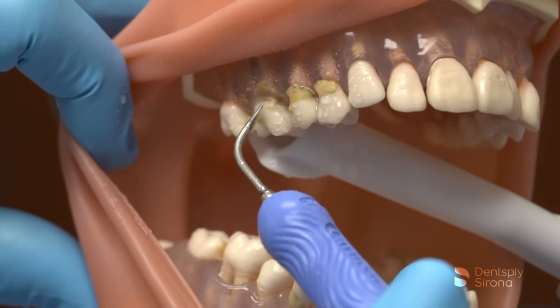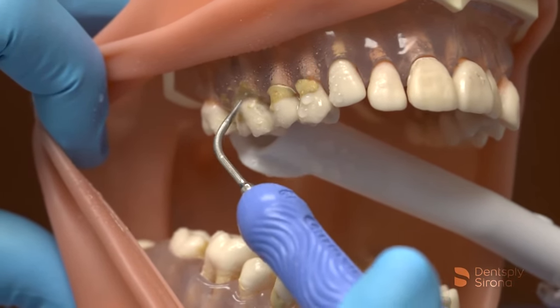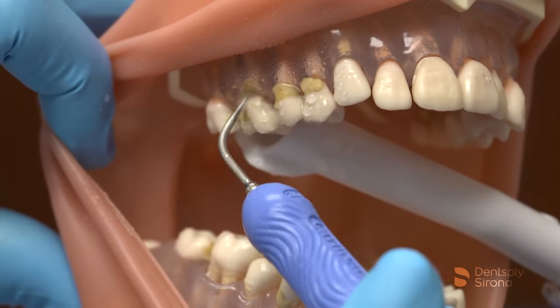These steps should be repeated in a methodical, channel fashion ensuring complete removal and thorough biofilm disruption.